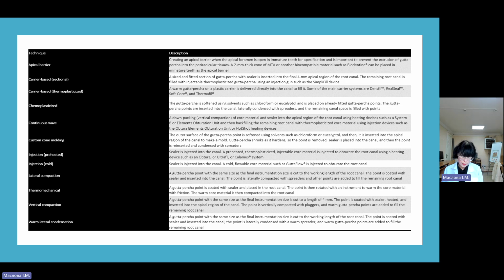This fluoropolymer is substituted with polymethyl acrylate. The new material has been found to have good sealing ability, high adhesiveness to dentine, and easy removability. Silicone sealers: GuttaFlow is a polydimethylsiloxane-based sealer which expands slightly on setting and is very radiopaque.